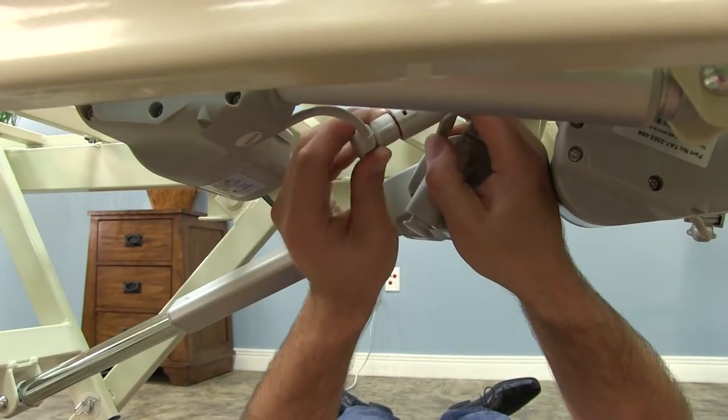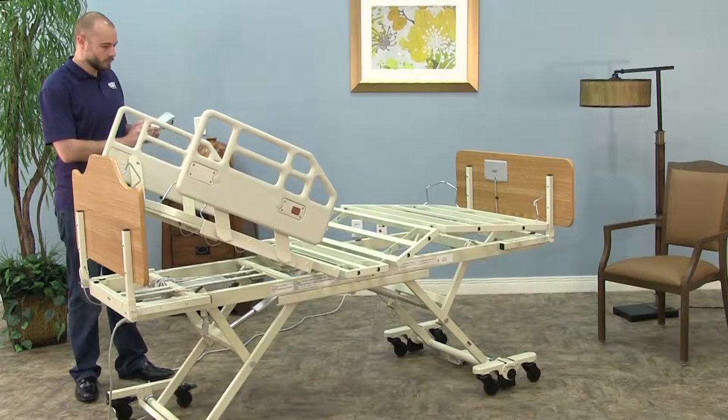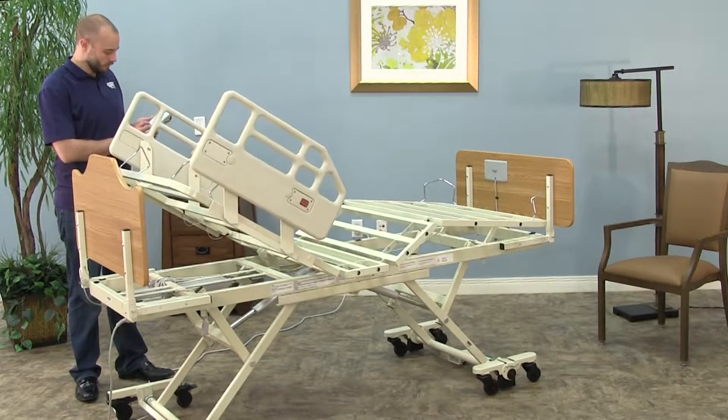Once you have the pins in place, reconnect the control cable. Using the hand pendant, check to make sure all functions are working correctly.